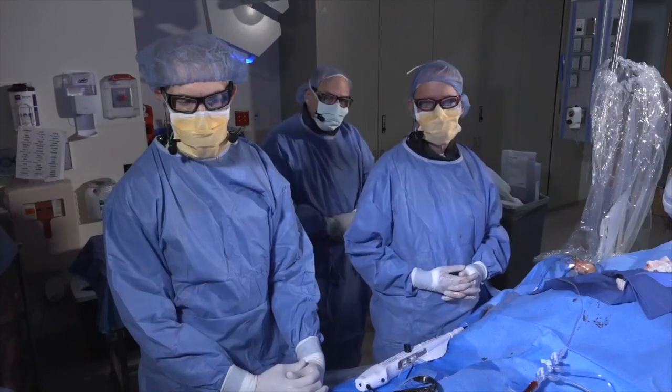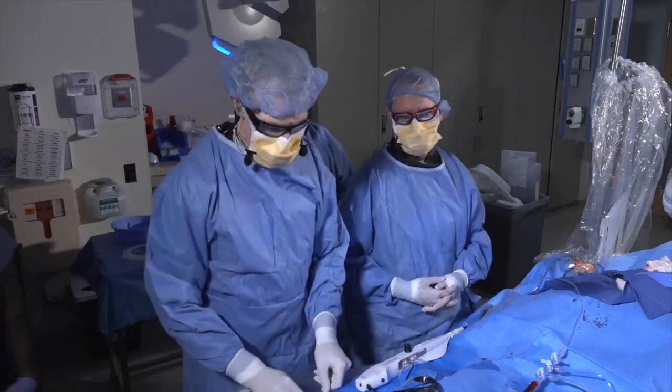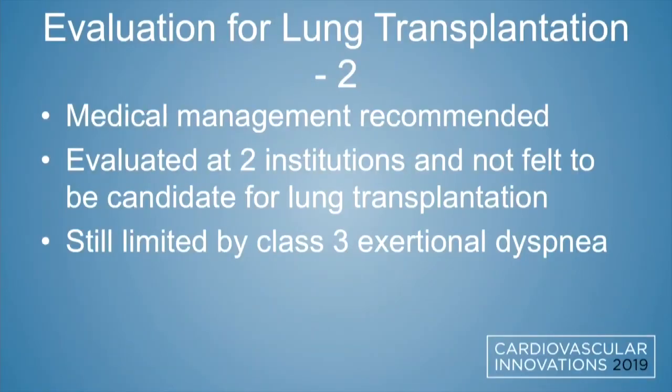So tell us what your plans are for today and what you've done already and how you formulated this case. Yeah, so we went and met her and sat down and went through things at length with her in the office, talked about the options. She's pretty petite, and the options for mechanical support are not great. We did do an angiogram today. We can show you her vessel caliber. So we settled on a staged procedure to do the ostial right first, and then the left main and LAD second. That also gives us an opportunity to confirm the angiogram, which as of now is about 16 months old.